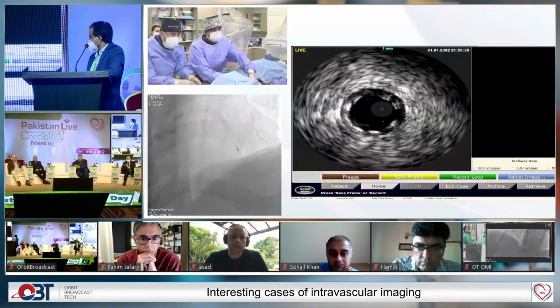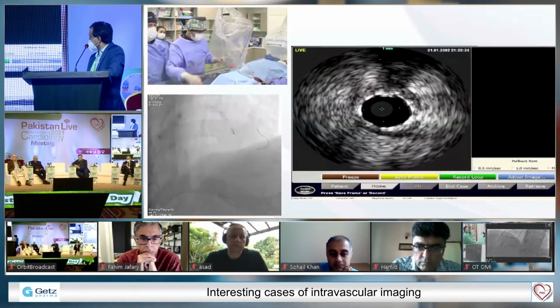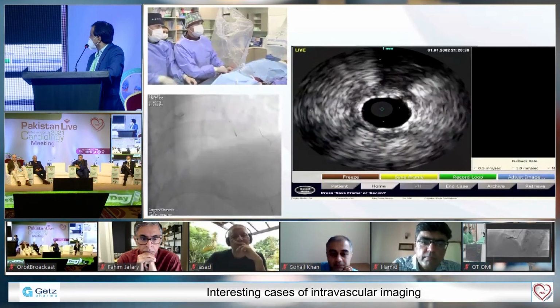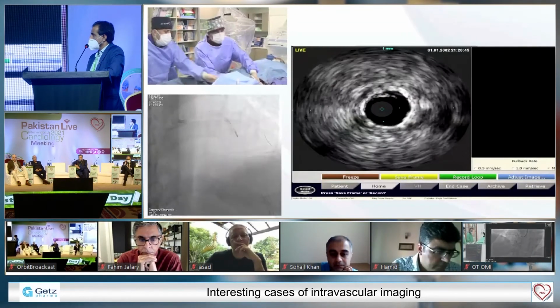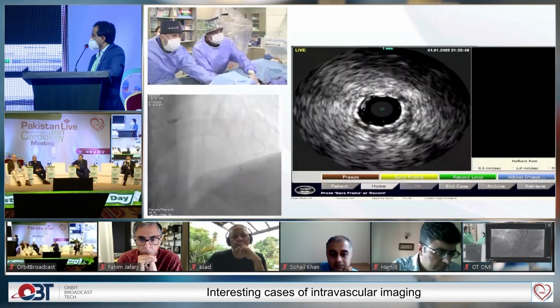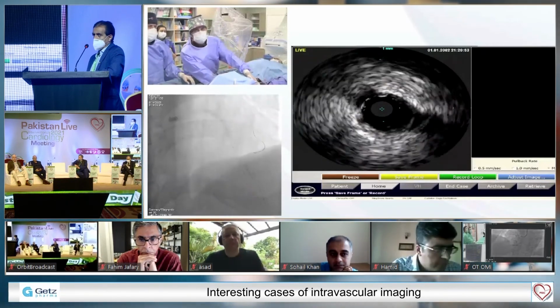Okay, better. Omar, are you going to post-dilate the whole stent? Sorry? Are you going to post-dilate?